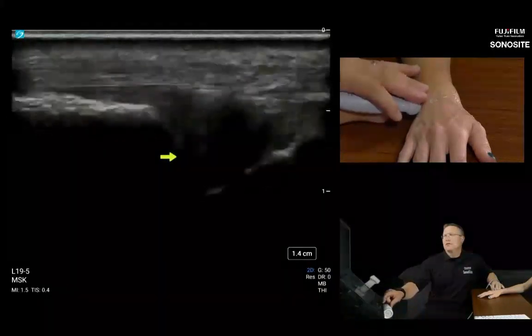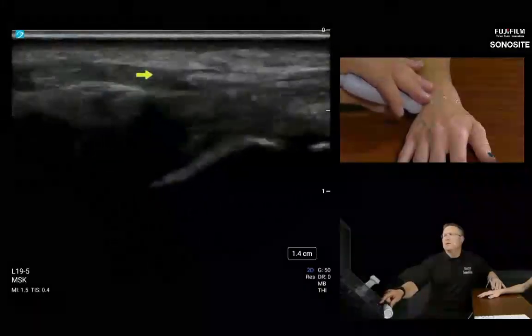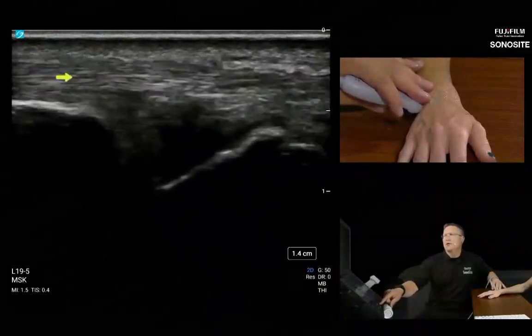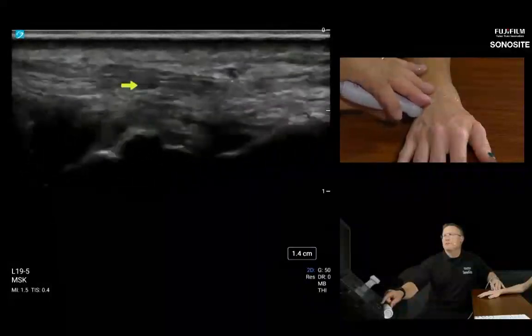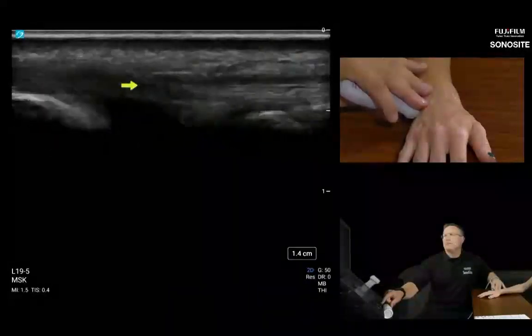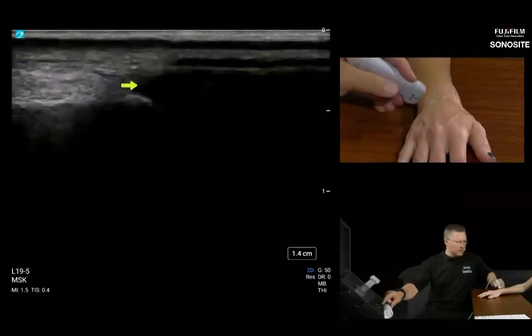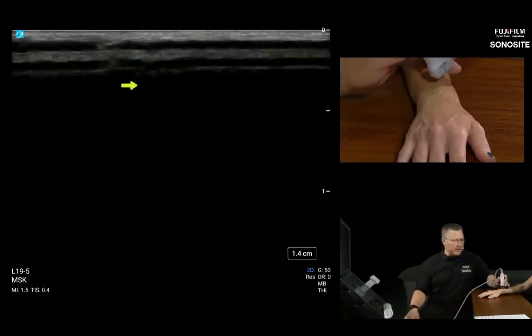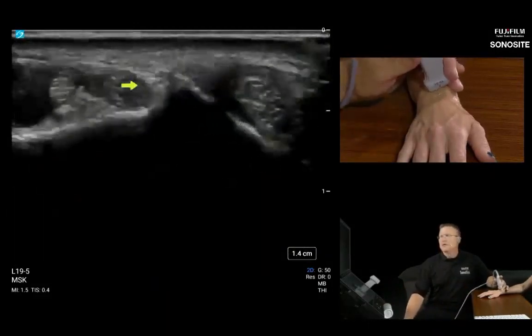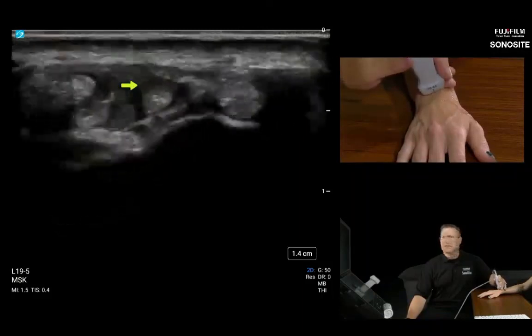But we leave the ulnar styloid following the extensor carpi ulnaris in long axis. From the extensor compartment survey, that concludes the extensor compartments. Let's go back to Lister's tubercle, and we'll quickly evaluate the scapholunate joint there.